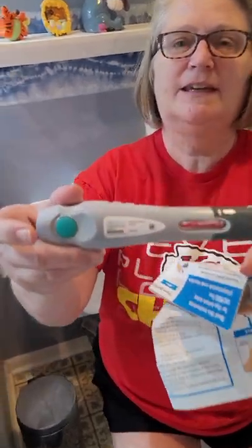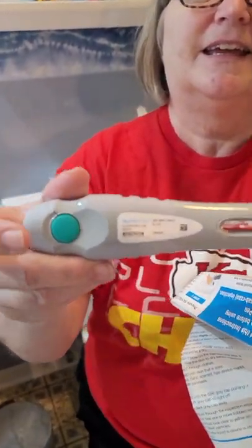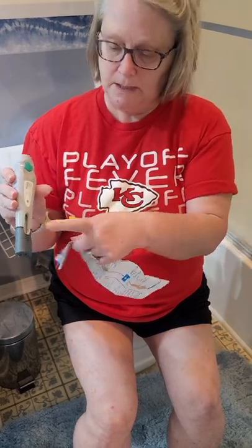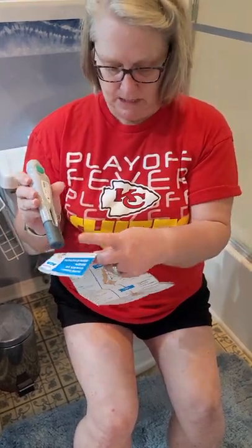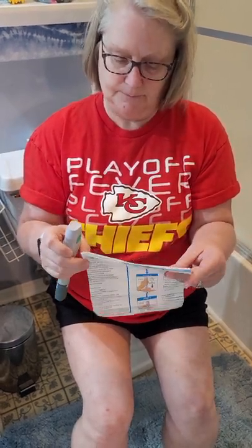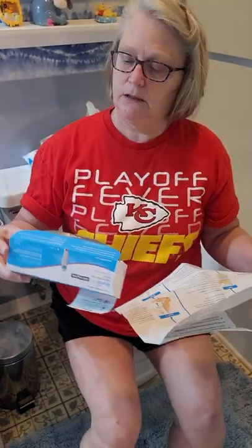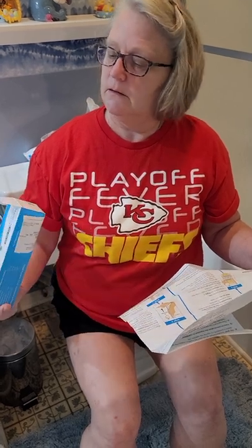Here's the pin. Can you see the pin? And there's the green button — the green activator button. Gray hand grips. Inspection window. Dark gray cap — do not remove until ready to inject. Check expiration date. I checked expiration date already. Expires August 2023. We're good there.